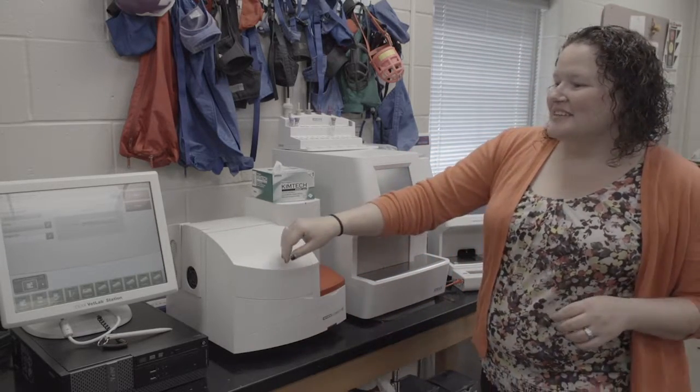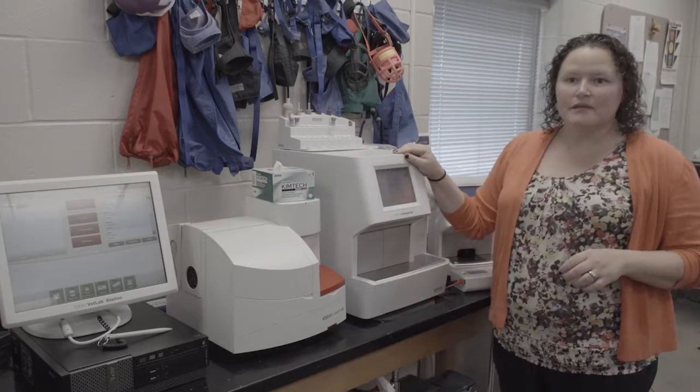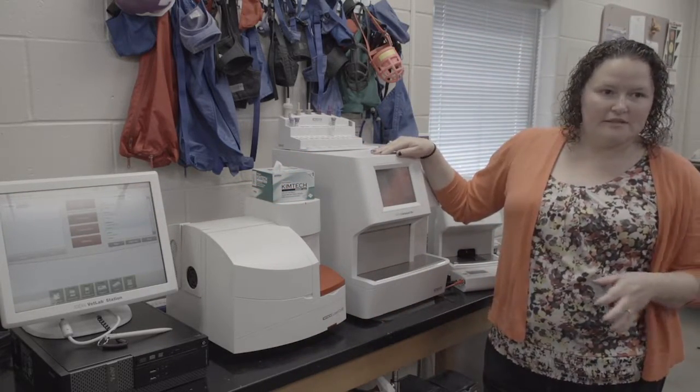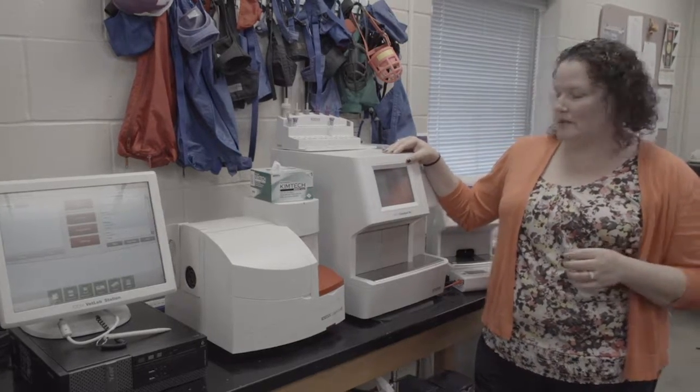Okay, so moving down the line then with our catalyst. So the catalyst is the chemistry analyzer. It's going to run your chemistry portion and your electrolytes and all those other slides that I mentioned.